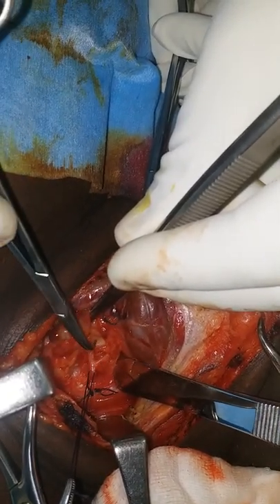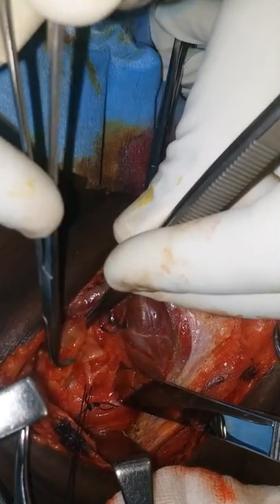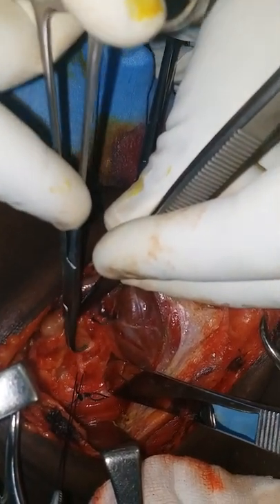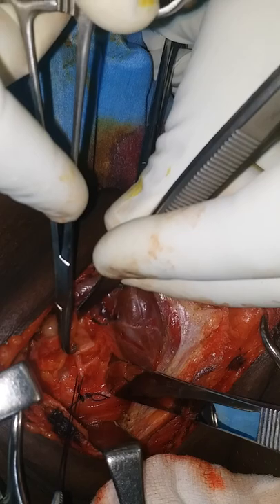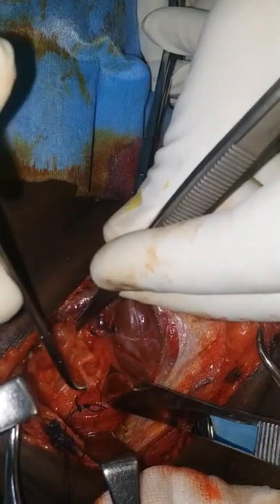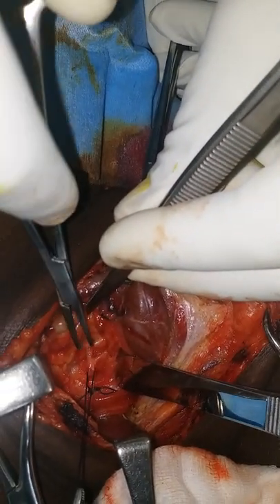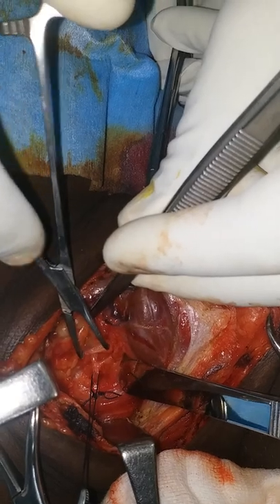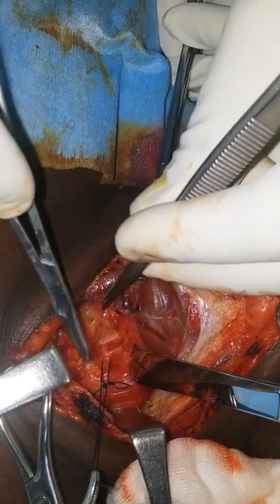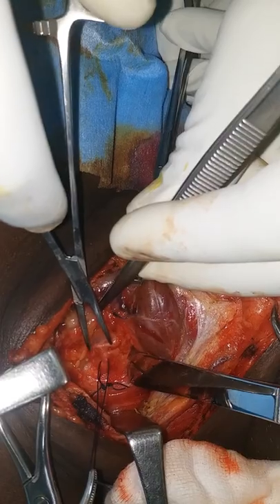That's the nerve. Very clearly you can see the artery comes below the nerve. This is the recurrent laryngeal nerve that has been pushed down. The main stem of the artery which is supplying this is coming over this. I have distracted the nerve and that is made to move over the vessel. Very clearly seen.